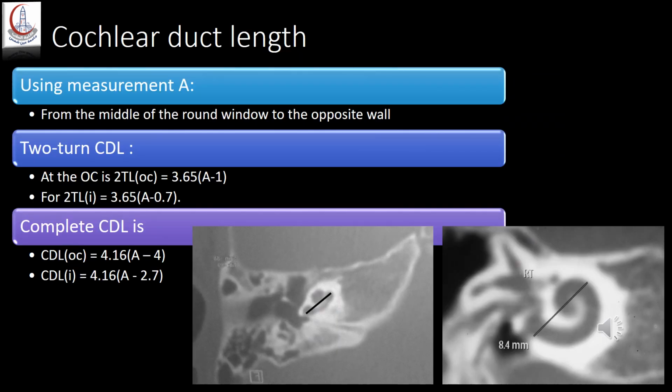When we are choosing our electrode, we have to adapt the electrode length to the cochlear duct length in which the electrode is going. There are many ways to calculate the cochlear duct length, and this is the optimal way to choose the right electrode for each patient in order to approximate as much as possible normal hearing using the cochlear implant.